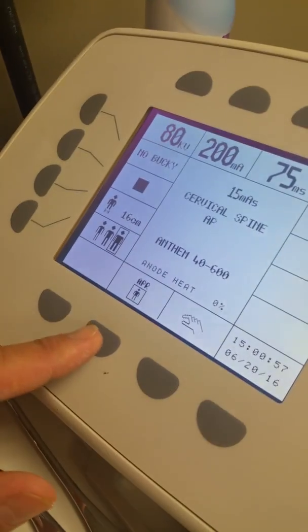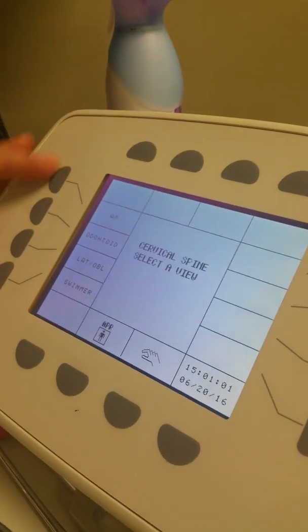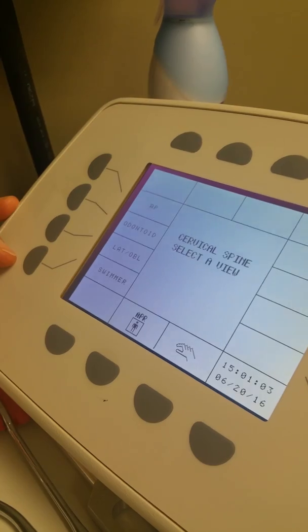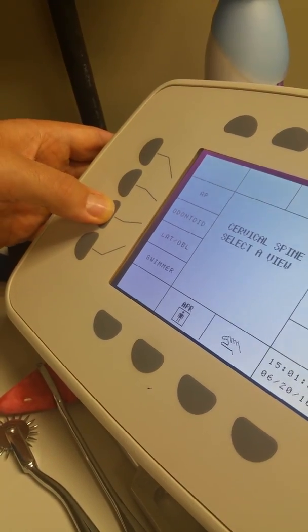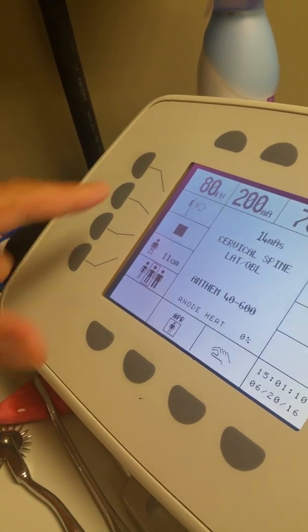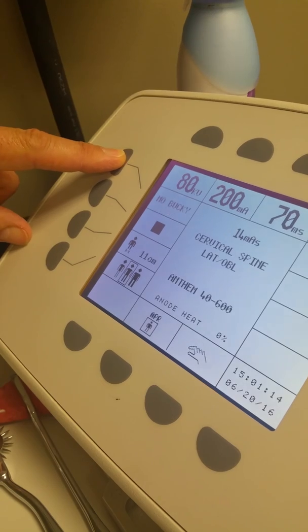Now we're going to go back to the APR at the bottom. If we click that once, we then pick up our different views. Since we already did the AP, we're going to move to the lateral/oblique. Click on that. Now if you notice up top here, it doesn't say no Bucky, so we have to click on that until it says no Bucky.